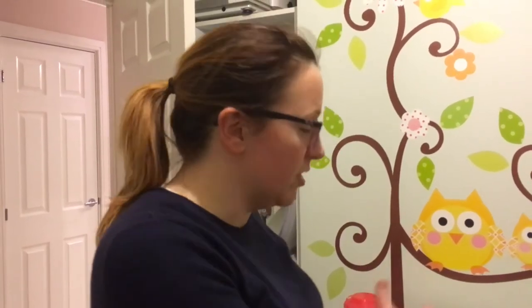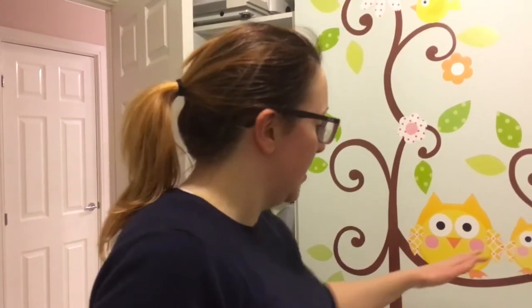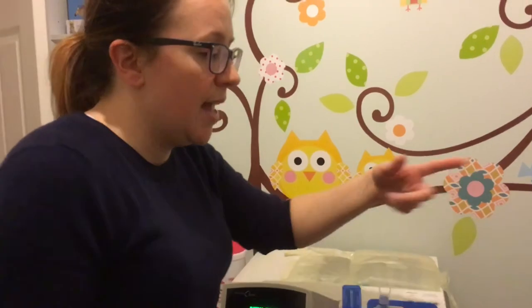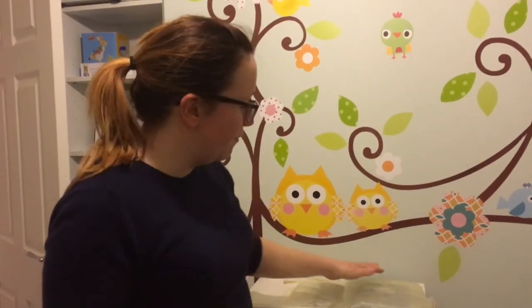So the procedure, after it's drained all that, is that it takes fluid from this bag up here and puts it into Ethan's tummy. He has 370 mils, and it sits in his tummy for a dwell period of 50 minutes. And then basically what that will do is it'll be cleaning his blood, pulling off any extra fluid. Then after that 50 minute dwell time it pulls it all back out — just like it's doing now draining — puts it into this bag, and then it starts all over again.